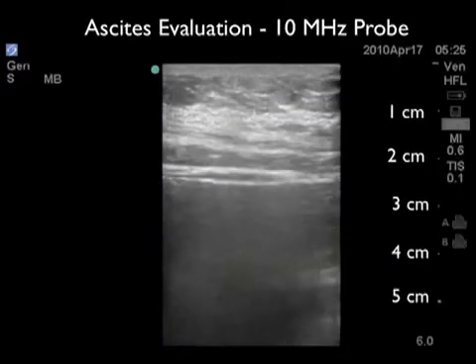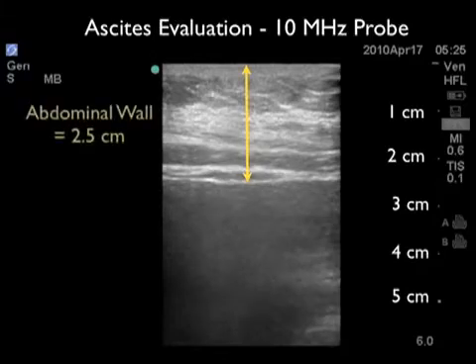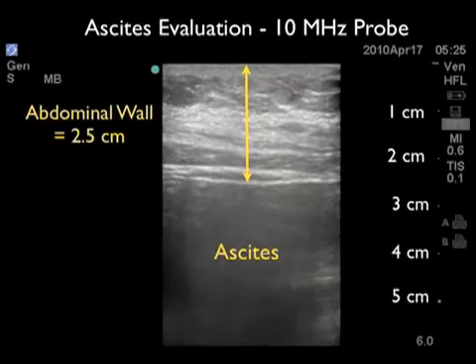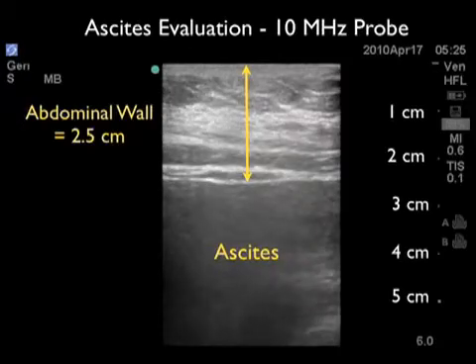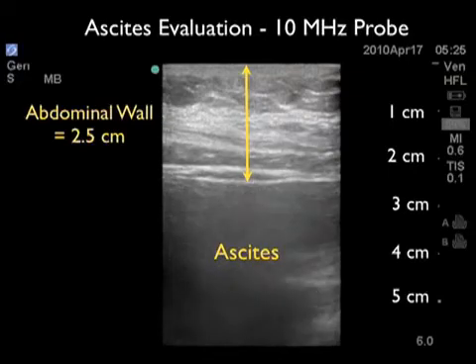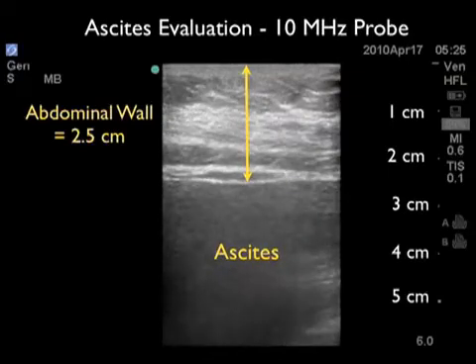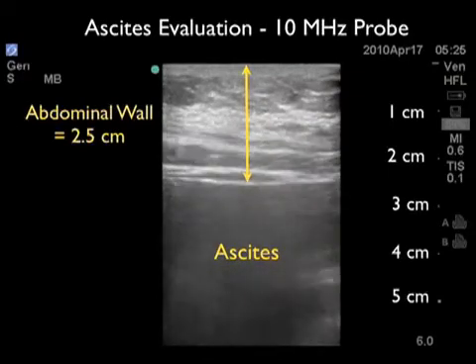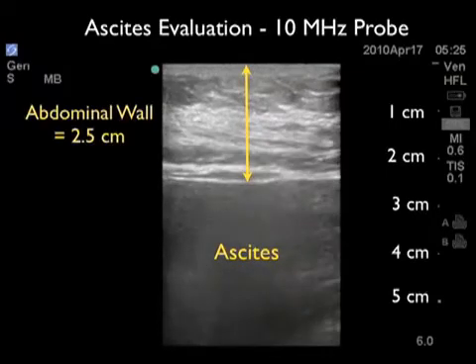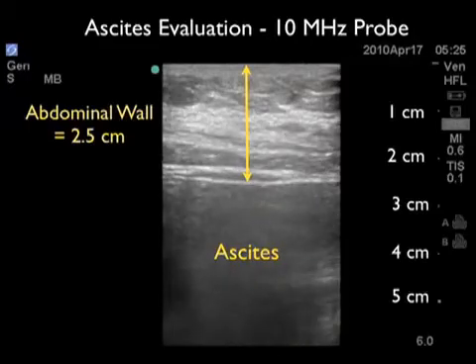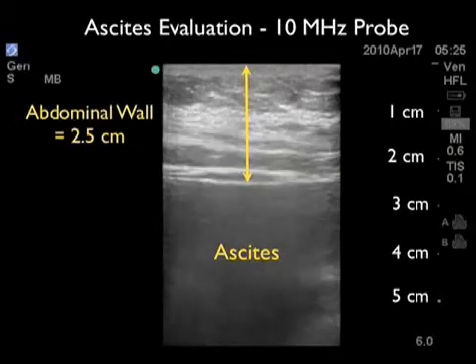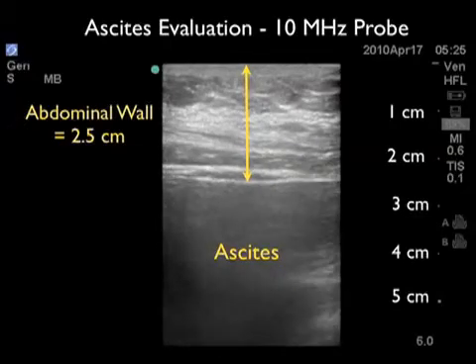In this video clip we've moved the probe slightly lateral from the last position in the same patient. Again we note the deep abdominal wall at 2.5 centimeters, indicating that a longer needle will be needed. But here we see a large collection of ascites and note the absence of gut sliding, denoting a larger pocket of ascites and a more favorable position for the paracentesis procedure. This is the position in which we perform the paracentesis using a longer lumbar puncture needle, and we're safely able to obtain ascites fluid for lab evaluation.